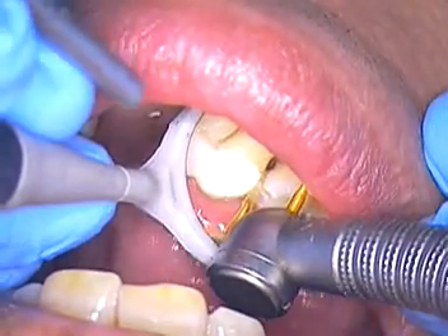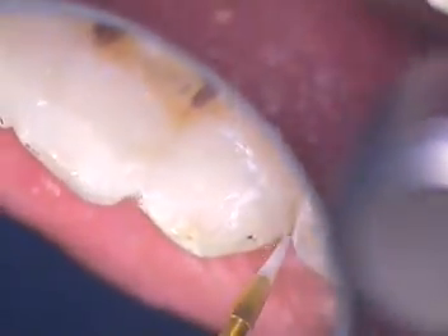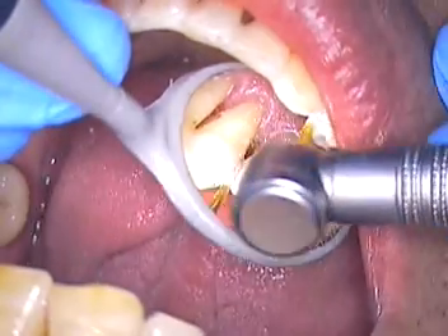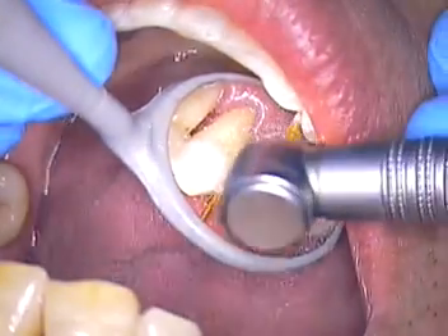Air on the mirror. I know where it is — it's a little overhang. Let me zoom in on that, let's see if I can pick it up. Just stay still right there, try not to move. Just a little overhang. Put your tongue there again. Just — is it okay now? A little bit. Oh, the adjacent tooth. It's sharp — we'll find it. Just one spot. We'll get it if we watch his tongue and see where his tongue goes.